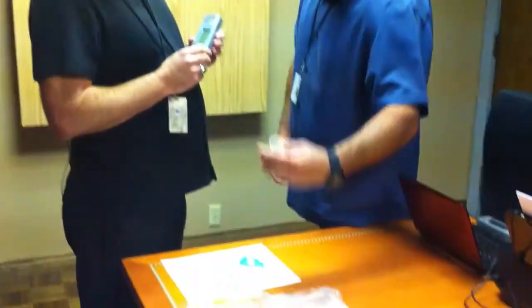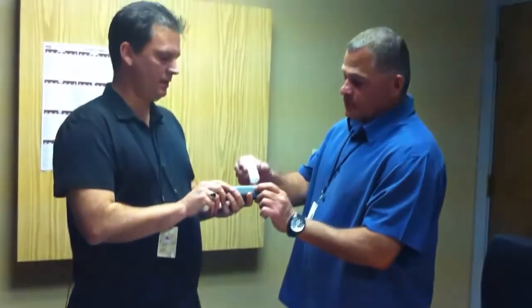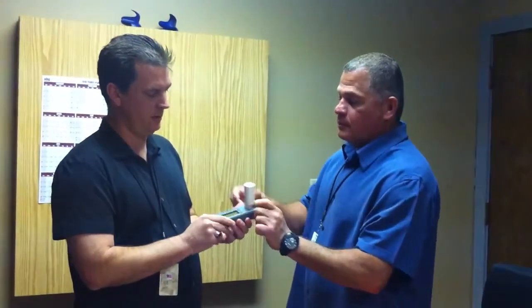Counterclockwise will release it. We're going to put it in clockwise and have the patient grab a mouthpiece. I'm going to put that on there so it's in snug. And nose clips.